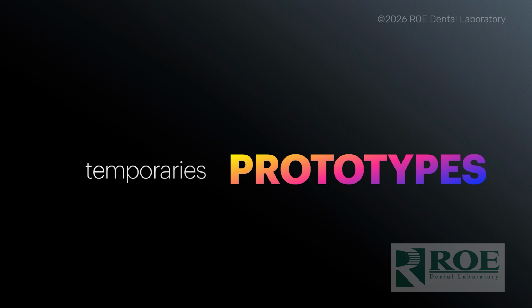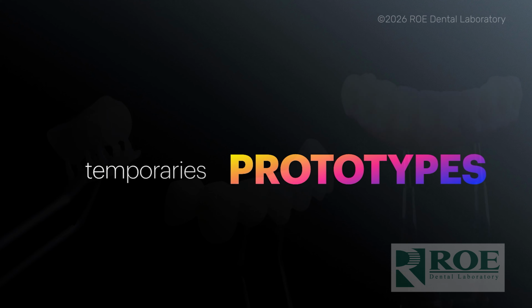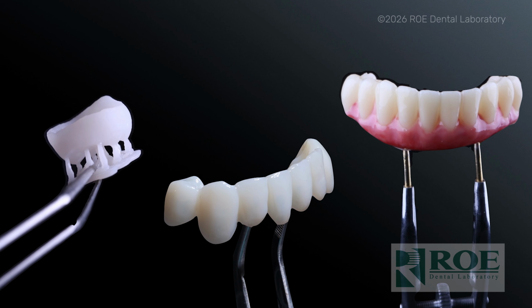And temporaries and prototypes, they come in all shapes, forms, and sizes, because we can have single teeth, which are great. And then we can get these long spanning bridges or full arch sextant quadrants, or even full arch on implants. And a prototype doesn't matter. The concept is the same. It's an exact replica of the desired outcome that we're trying to achieve.